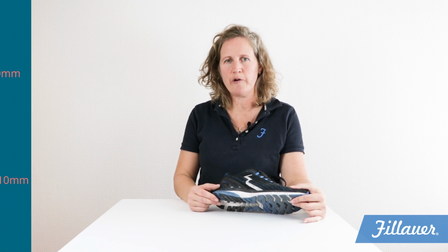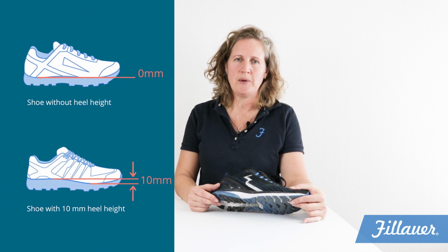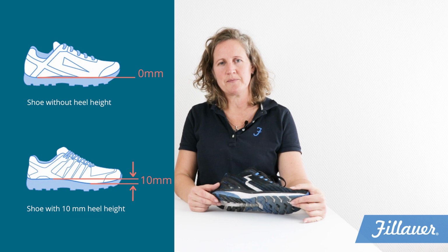A good AFO needs to fit the patient as well as the shoe. The other measurements on the form are there to make the orthosis fit the shoe. The heel height of the shoe is the B measurement on the form. It's the difference in height between the heel and the forefoot. For most shoes, this is around 10 millimeters, but this can of course differ.